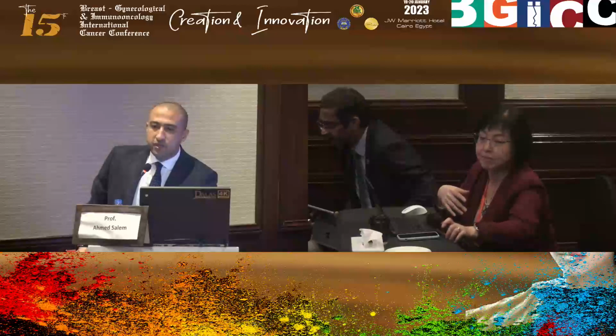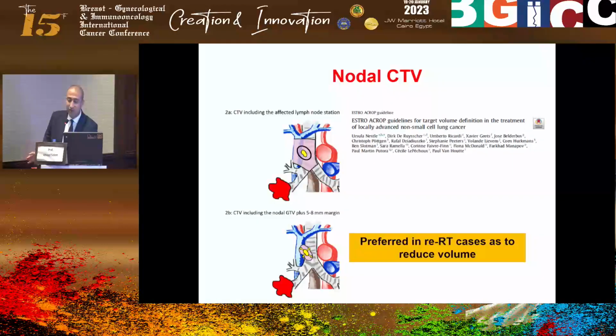Yeah, that's absolutely a good comment. After we try to get you to do some on-site hands-on contouring, I'll show you the guidance that I have for re-irradiation. And yes, definitely, in re-irradiation cases, if you're worried about organ at risk doses, you can potentially drop your CTV margin down to 0 if you're super worried about an organ at risk nearby.